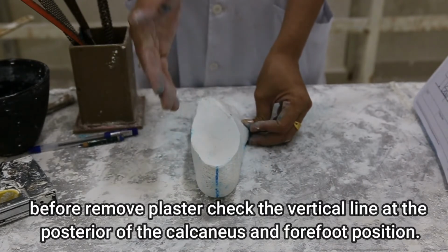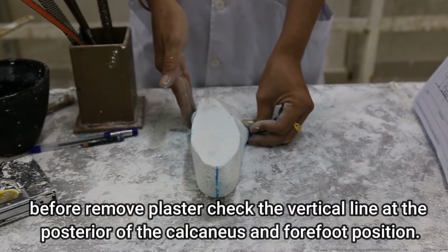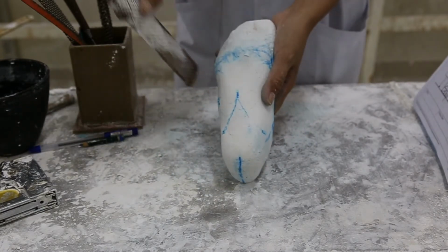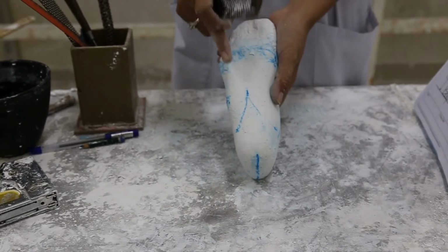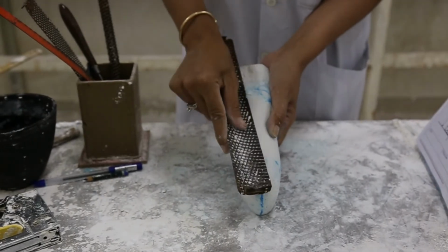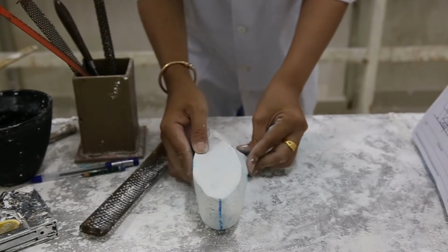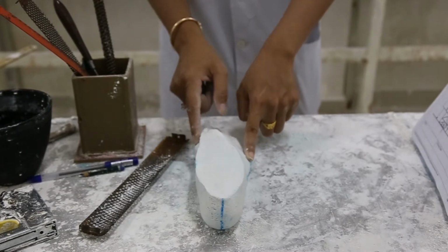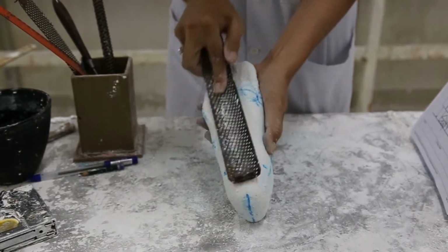And after we reduce that, we also need to check how the hind foot and the forefoot are. They must be parallel to each other. So as I said, the alignment is not correct. Mainly it bumps at the lateral side of the foot, so I'm going to do the reductions on the lateral side. It's a little bit more. Now it's bumping in the middle part because it shakes. Yeah. So I'm going to reduce in the middle part.